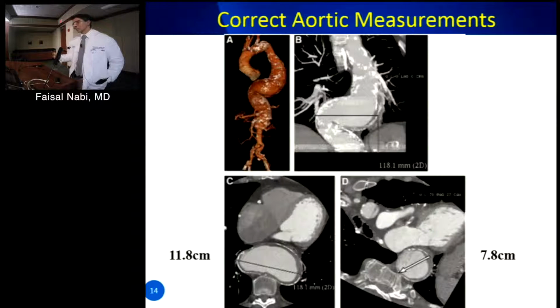The problem with echocardiography is why you use leading edge to leading edge, or inner to inner. Most of the time, the trailing portion of a structure is very difficult to decide where it is. You have the anterior portion of the aorta and the posterior portion. The measurement is not a problem in the anterior portion; I can define the anterior surface.